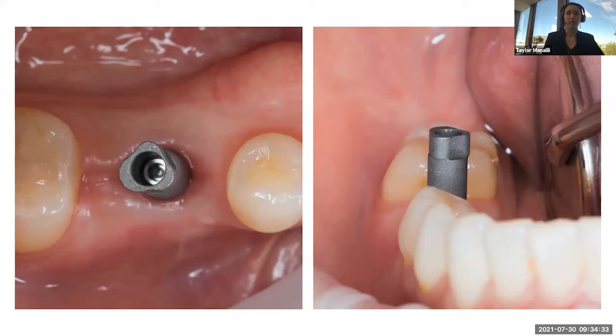There are a ton of different scan bodies out there on the market. Some have short and tall scan bodies. Glidewell has recently switched to this titanium scan body, which is great for so many reasons. It has a new connection, it's single length, and it's titanium, so you can easily x-ray it.